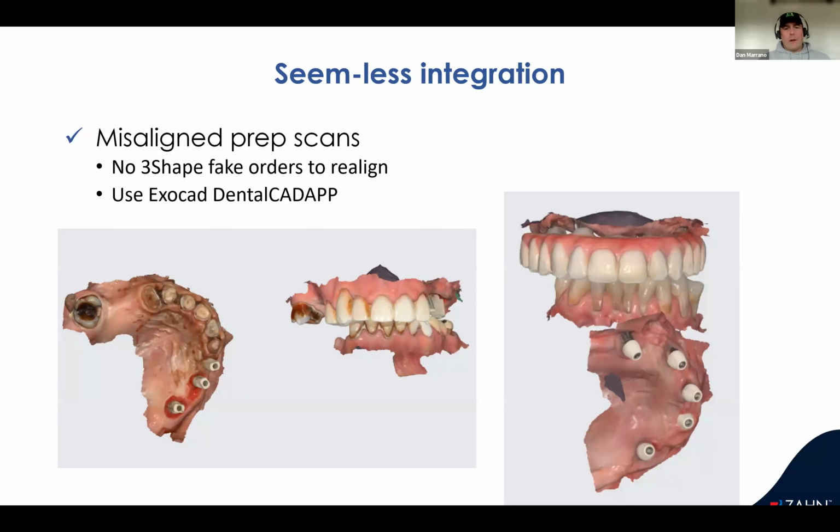So starts our integration. When I had exocad and I had my training, I had a lot of false information kind of being thrown at me, that we're so much better this way, so much better that way. And it was kind of antiquated. So I was having trouble figuring out how I was going to bridge the gap. I never planned on really getting rid of both, so I needed to figure out how I was going to integrate them both. I see great value in having both.